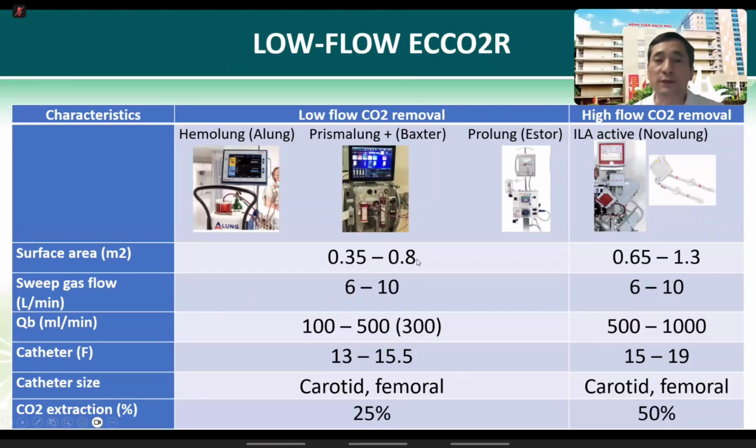And when you want to increase the removal of CO2, of course, there are two ways, or a combination of both. First, you can increase the surface area, increase blood flow, and you can remove more blood CO2. If you compare the two different types, you see the larger, bigger one can remove more, double this level. But of course, with a catheter or cannula like this, you need to have very special people to do the procedure.